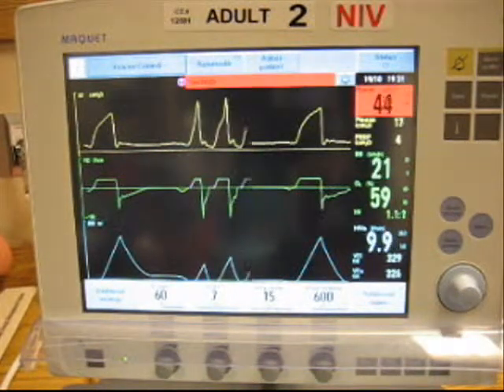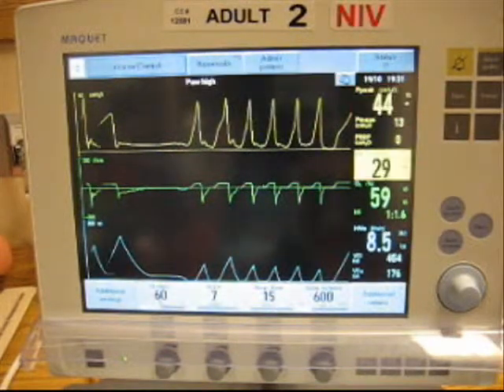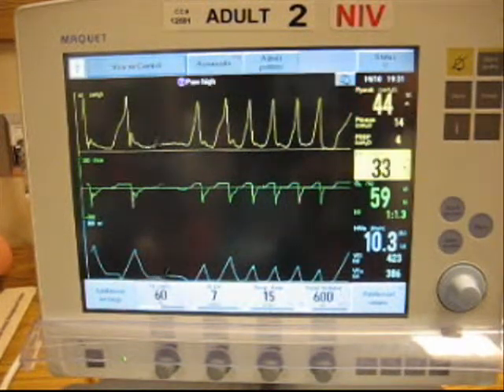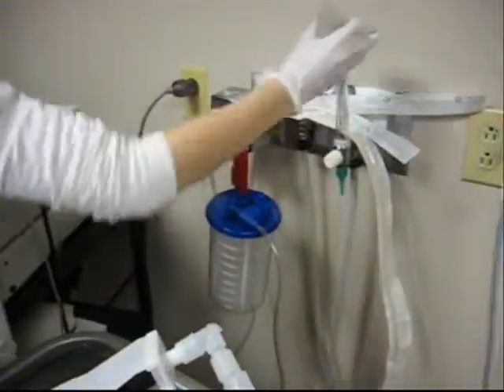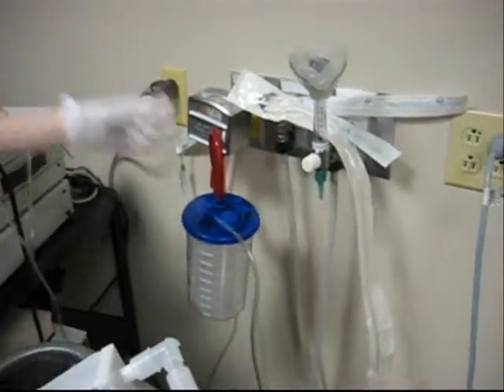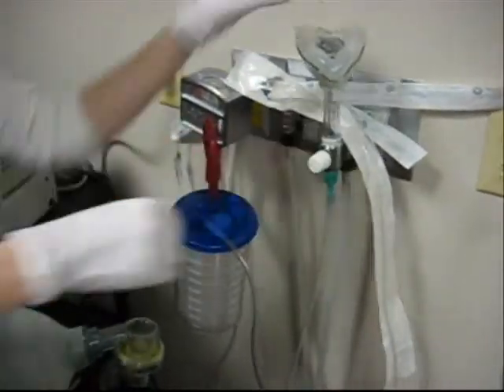Observe the patient for any unfavorable signs and symptoms and react quickly and appropriately to the alarm conditions that are presented. Ensure equipment such as airway supplies and resuscitation bags are properly placed and attached at the bedside according to the local site policy and procedure.